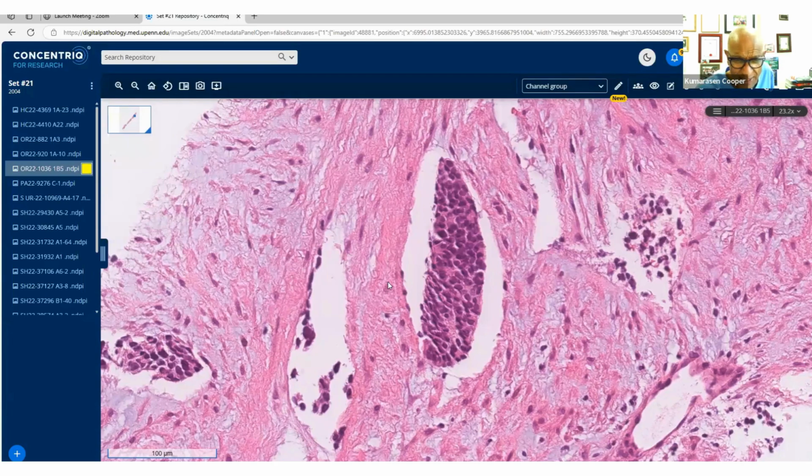But like I was saying, these are artifacts. These spaces are artifact. They're not real. Okay. Here's a vessel here with some space. So this is just separated from that. So ER is negative. What else did you want?